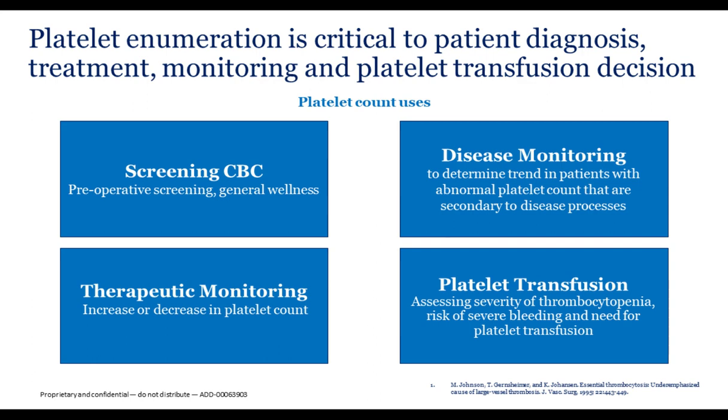Therapeutic monitoring: increases or decreases in platelet counts are important when monitoring patients, such as on chemotherapy or other process monitoring. And of course, platelet transfusion, ultimately assessing the severity of thrombocytopenia, the risk of severe bleeding, and or the need for platelet transfusion.